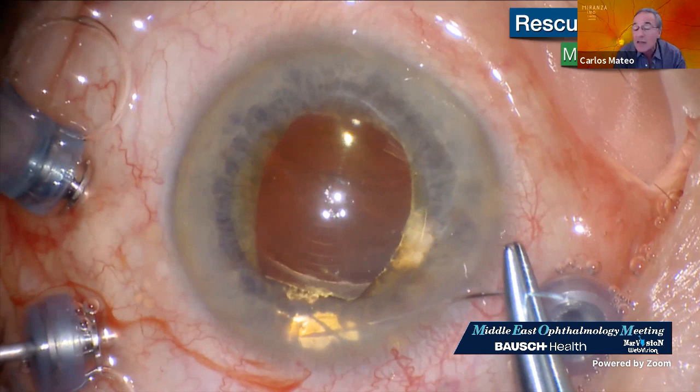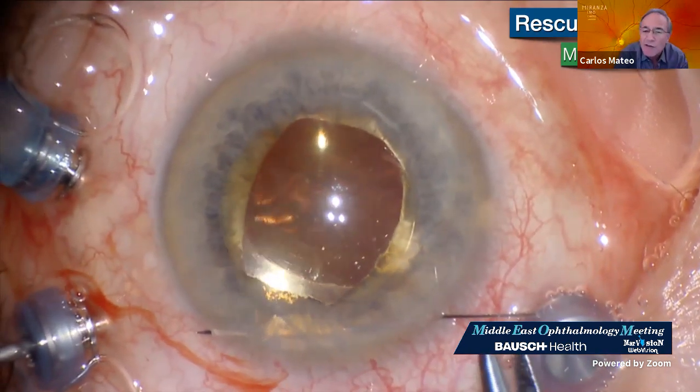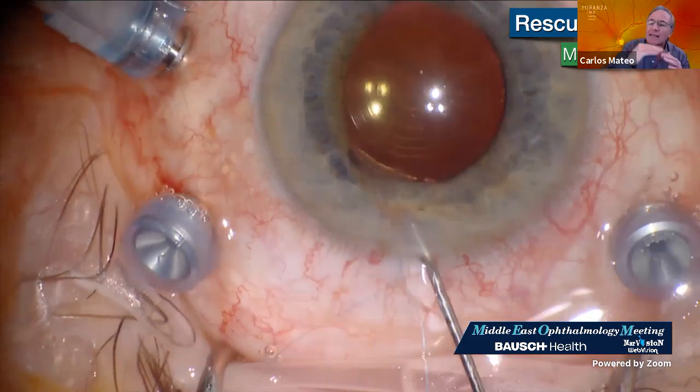And this patient at the end went to 20/20 vision in 1 week, but you have to consider that at the end, the effective position of the lens changes. It's 1 diopter of myopia because the lens is a little bit more anterior than the position it was before.